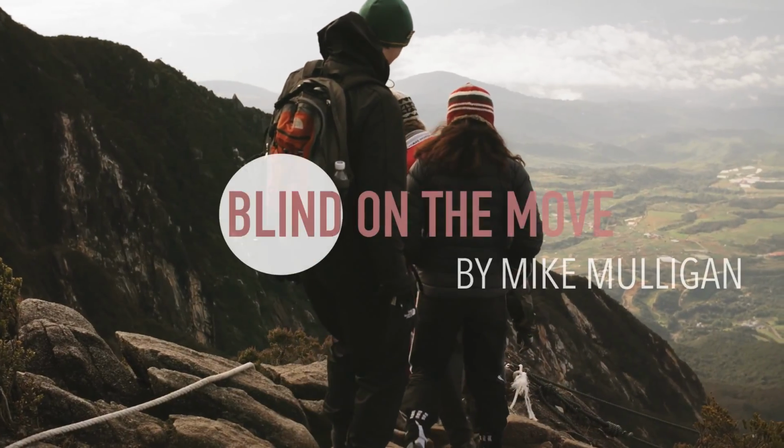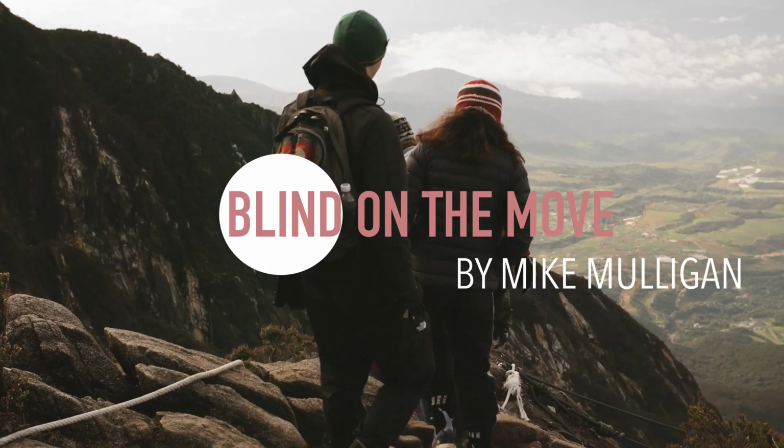I am a certified orientation and mobility specialist, and in today's video I will be demonstrating how to do the touch and slide cane technique when using 2-point touch. The touch and slide technique is really beneficial when trying to detect subtle textural changes in a person's walking path or even subtle drop-offs. For example, a big one is finding where the curb meets the street at a curb cut. That's a good example, and I'll demonstrate that in a minute.